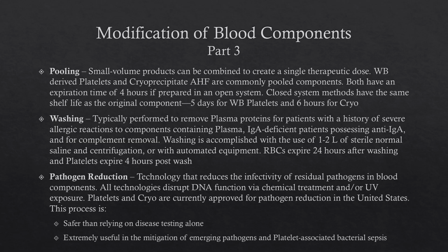That's where pathogen reduction really shines, because you don't have to test for it. No matter what's in the blood component, you can use the PRT technology and eliminate the risk from the transfusion.